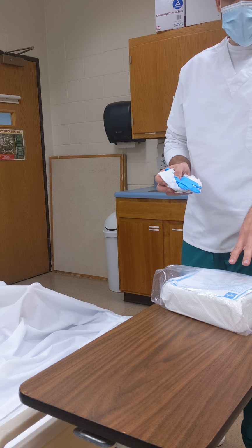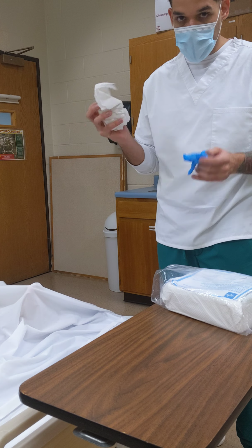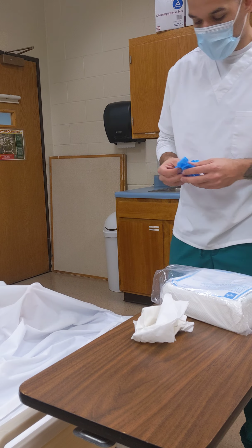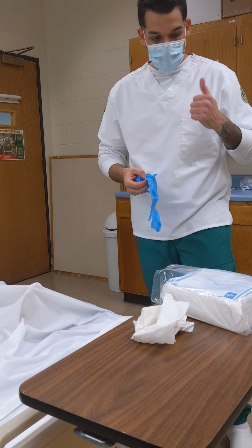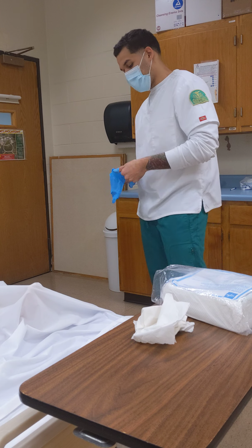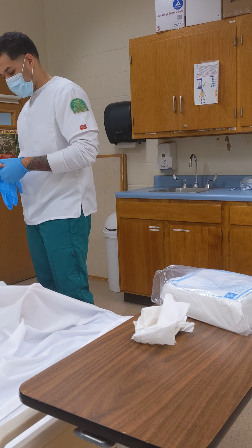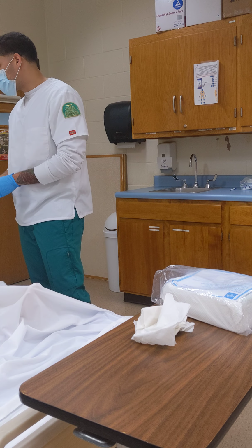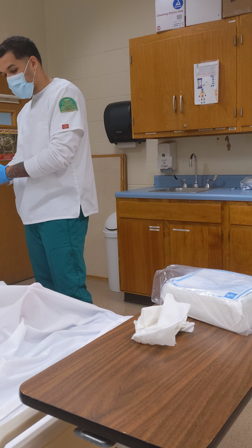And this normally wouldn't be in here. These paper towels are going to be for the pericare, because I don't have washcloths. And I would usually go wash my hands, get gloves. Ask the patient if they have any allergies or any questions or concerns before I start.